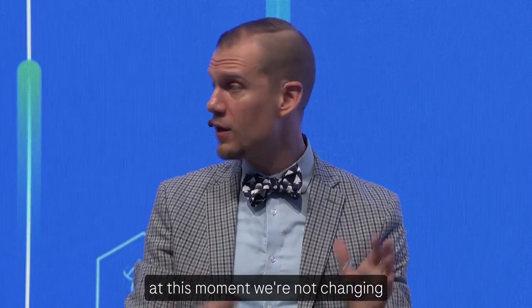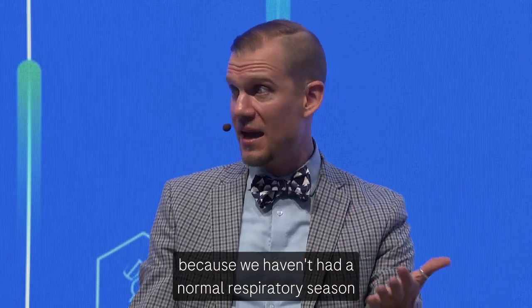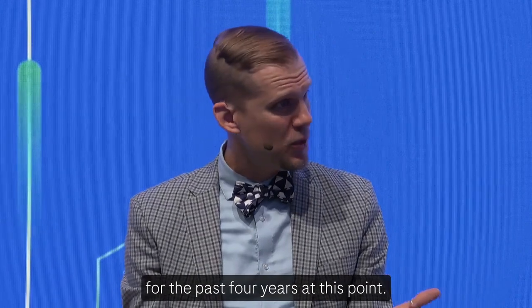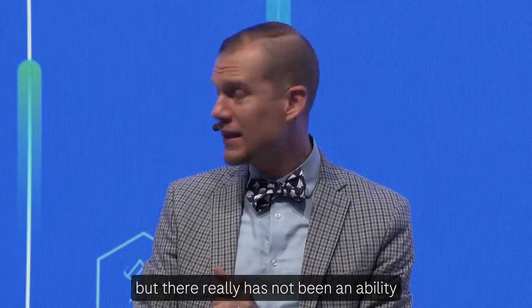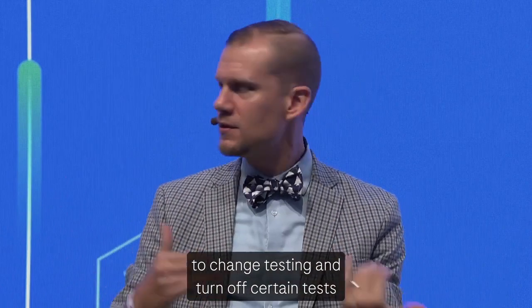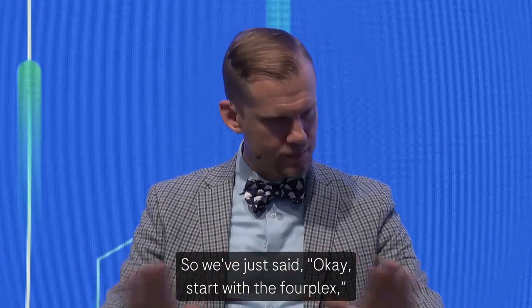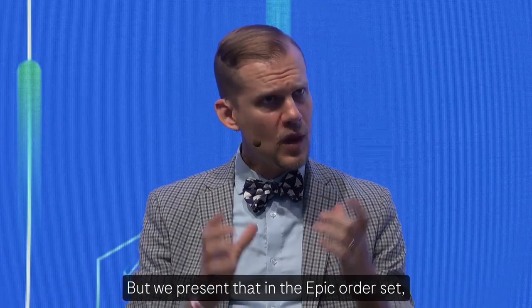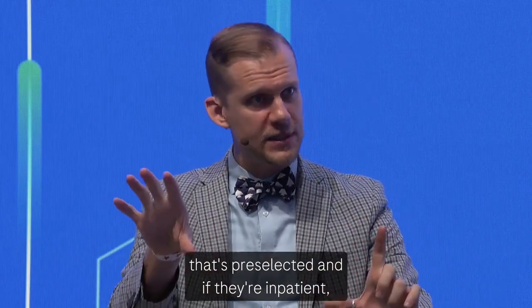And something that maybe we'll talk about in a moment, at this moment, we're not changing based on respiratory season because we haven't had a normal respiratory season for the past 4 years at this point. Maybe this year will be slightly more normal, but there really has not been an ability to change testing and turn off certain tests and turn others on. So we've just said, okay, start with the 4-plex because we've seen a lot of flu and a lot of RSV. But we present that in the Epic order set, where when you open that order set, that's pre-selected.